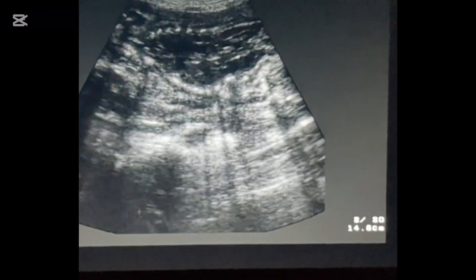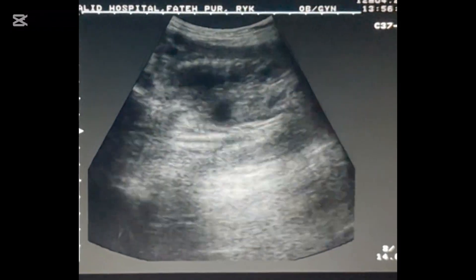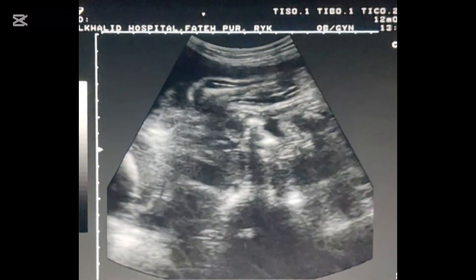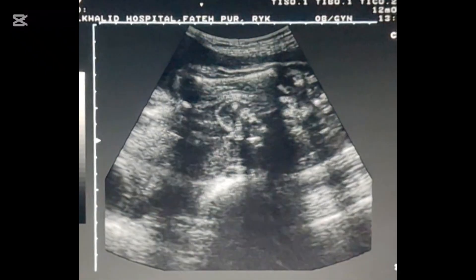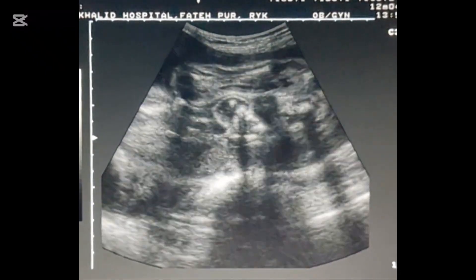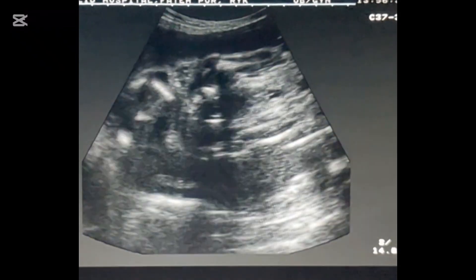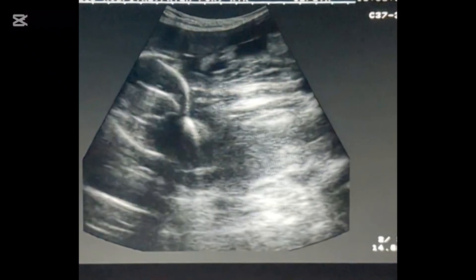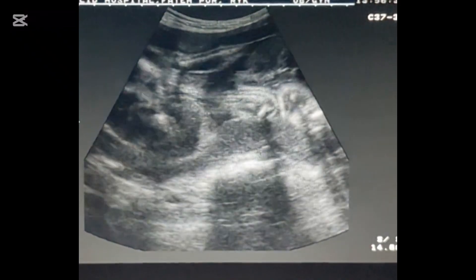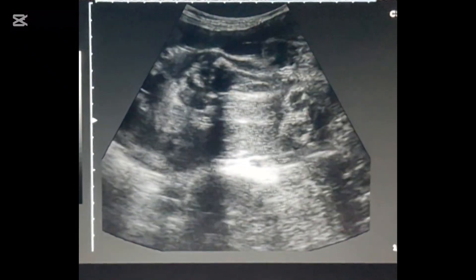The placenta is on the fundal wall. If the bones of the fetal head are collapsed into each other, this sign is called Spalding sign.